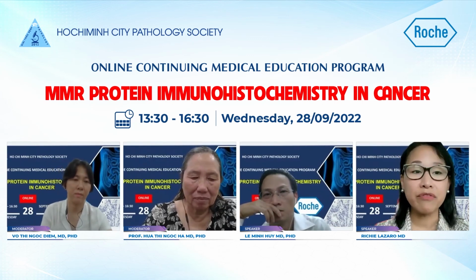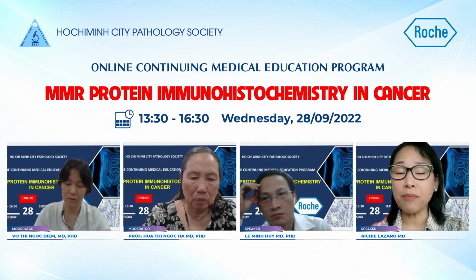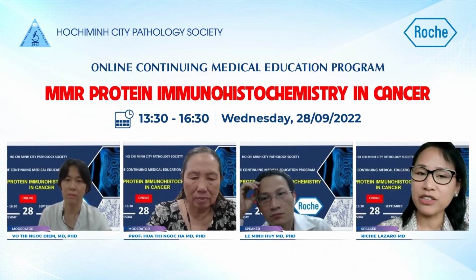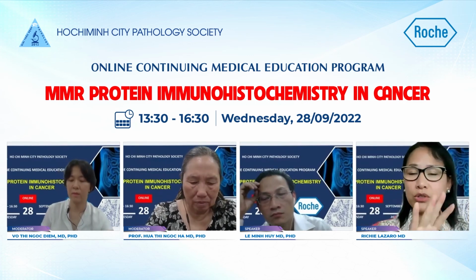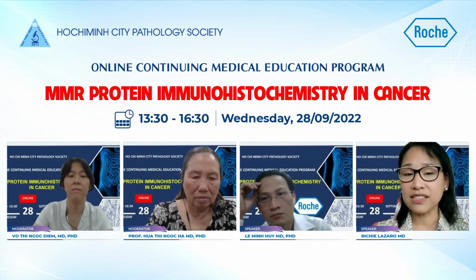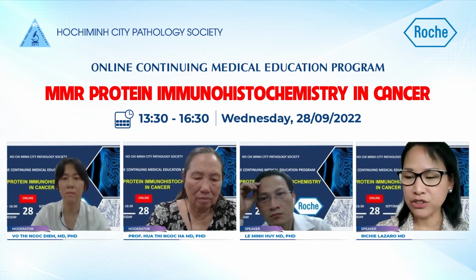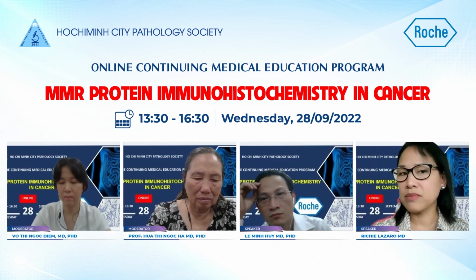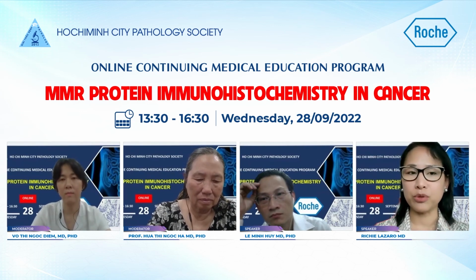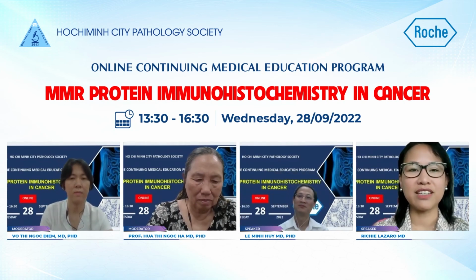And when it's equivocal. So when the tumor cell nucleus is strongly positive, I think that one is clear-cut intact, right? Comparing it with the internal controls, that's also acceptable staining. But if it's weakly staining or not stained, just double check, compare with the internal control, and be sure that you can confidently call it loss of protein expression. That's what I would suggest.